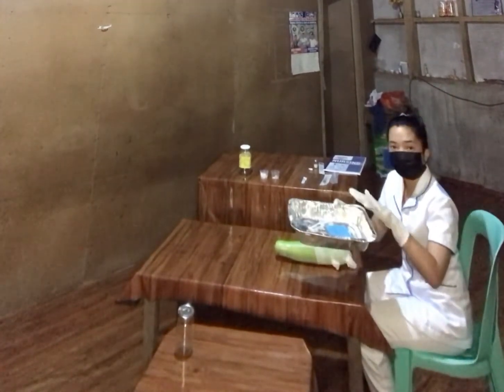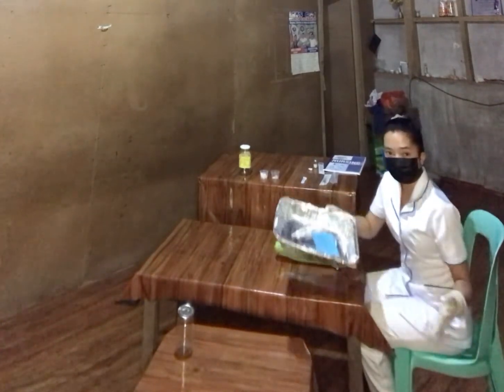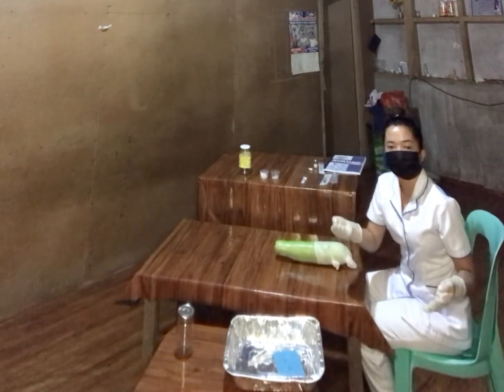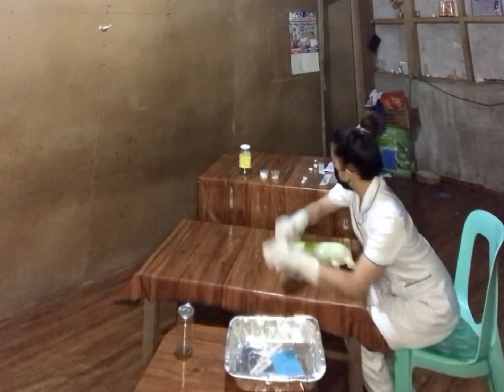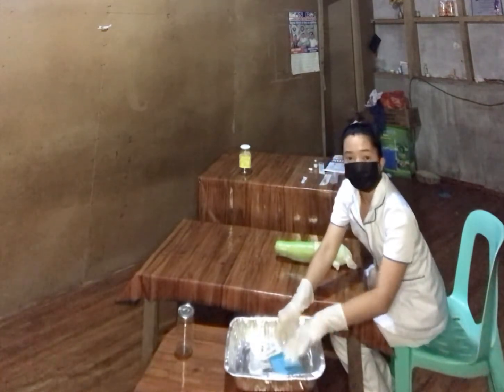So this is the medication tray of the patient. So now arrange the medication on a hypodermic tray. So I will arrange.